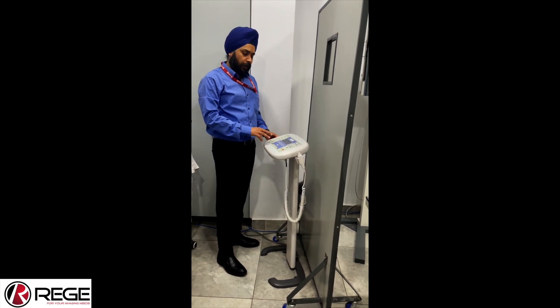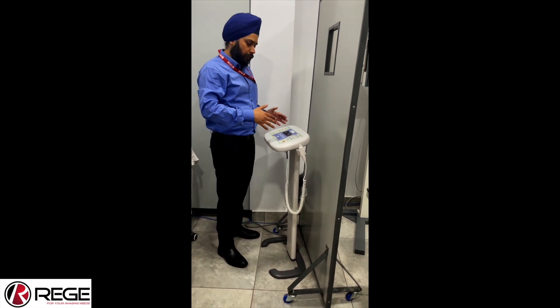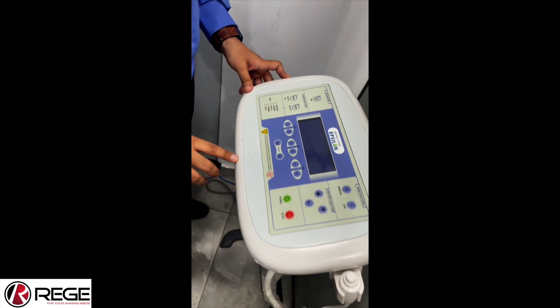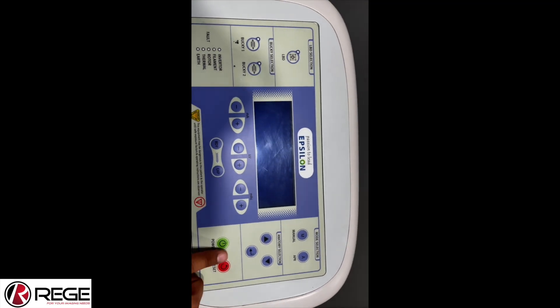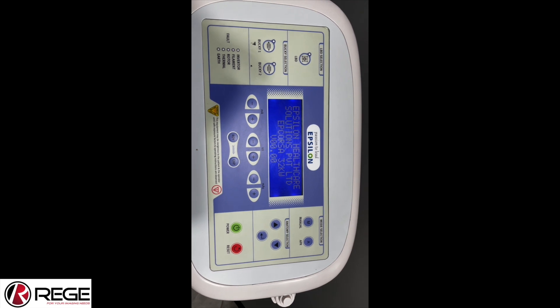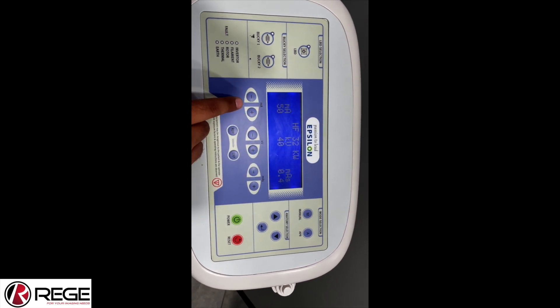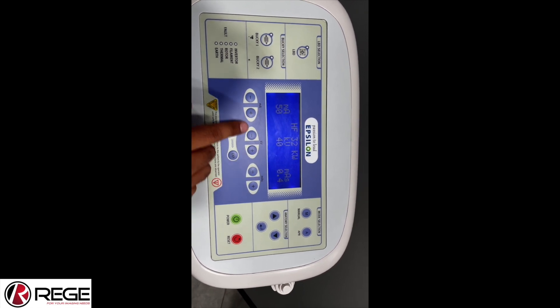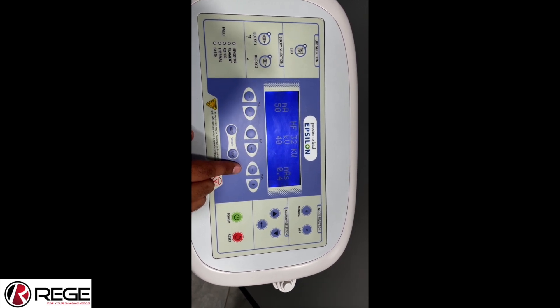Now I will show you the control panel of our Epsilon X-ray machine. This is the power button, and it reads 32 kilowatt EP Corsa, which is the model name. As you notice, this is a three-point technology: MA, kV, and MAS. The advantage with our equipment is that we can set MA, kV, and MAS — all three can be set individually. So independently they can be operated and the best image quality can be generated from the machine.